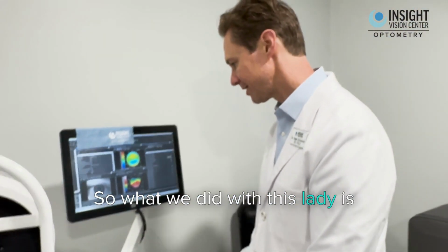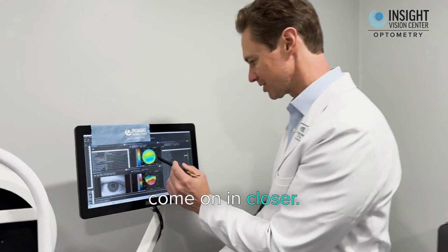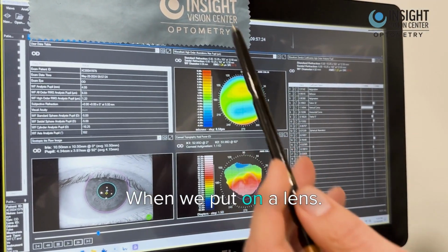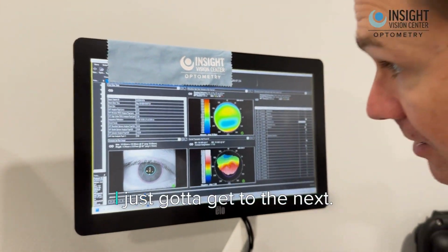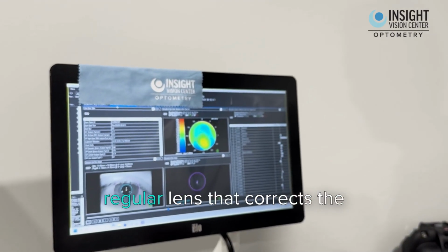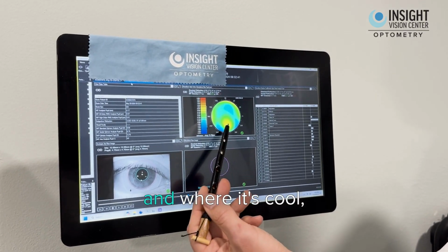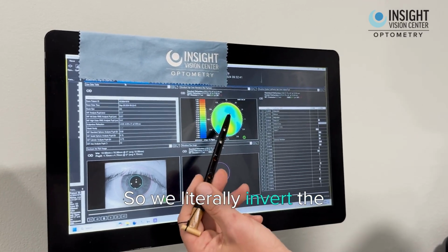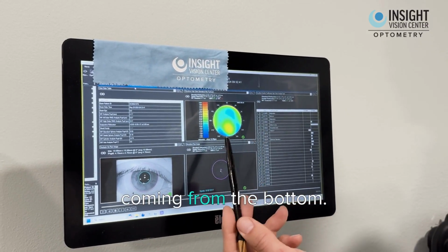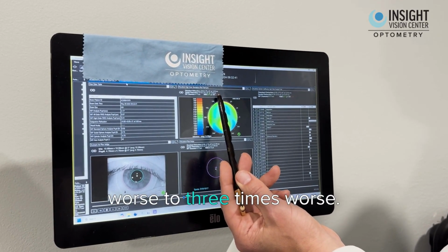So what we did with this lady is after doing the first scan, which is with the bare eye, come on in closer, you'll see that we have this hot spot here, cool spot here. When we put on the lens, a regular lens that corrects the lower order aberrations, where it was hot is now cool, and where it's cool, it's now hot. So we literally invert the aberration profile. So if she was getting glare coming from the top, now it's coming from the bottom. But the amount of glare has gone down tremendously. She went from being 10 times worse to 3 times worse.